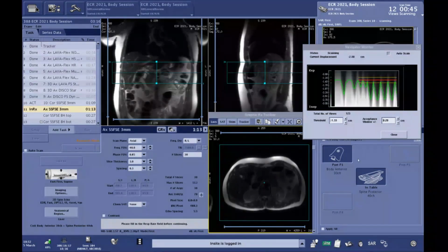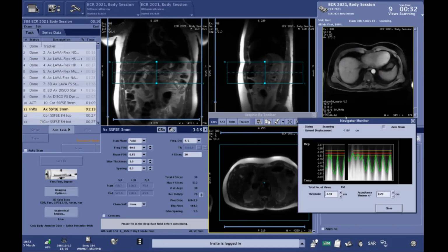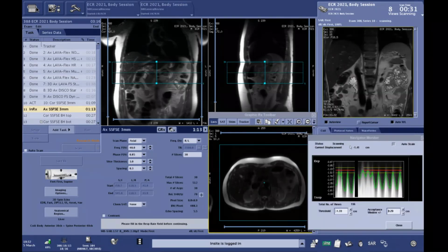Thank you, Bastien. That's true, and I think we will show how AirTouch is powerful at the end by doing a thorax, abdomen, and pelvis in 2 stacks without doing anything. It will be a really free positioning technique. I will show you that.